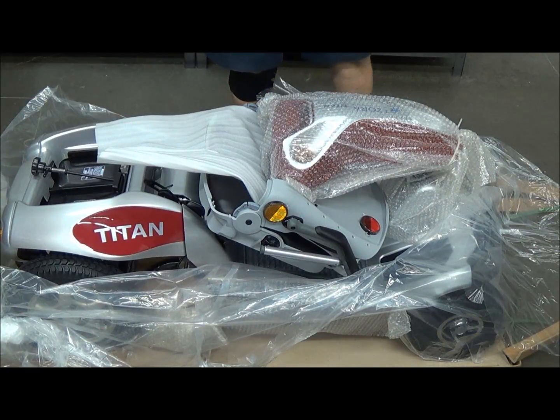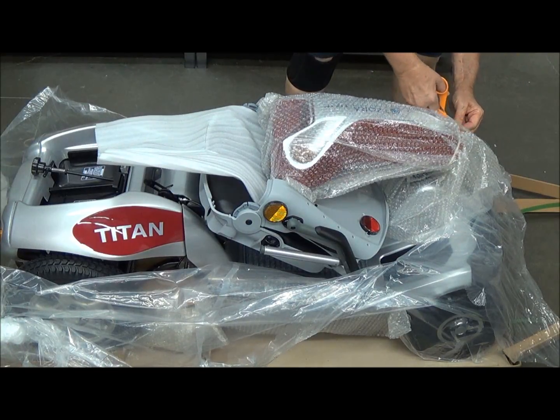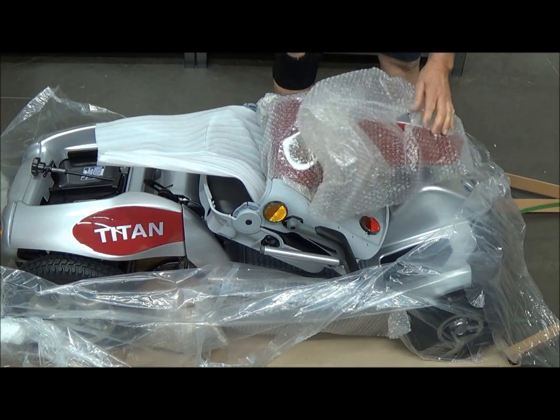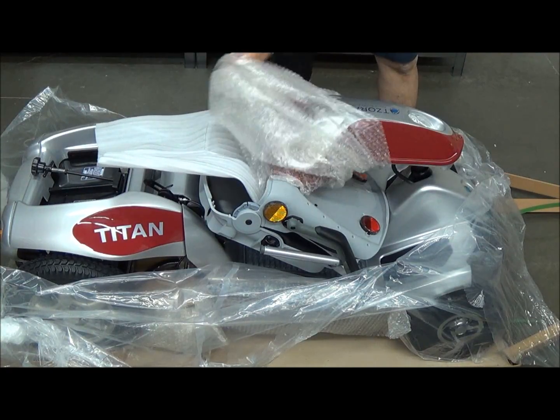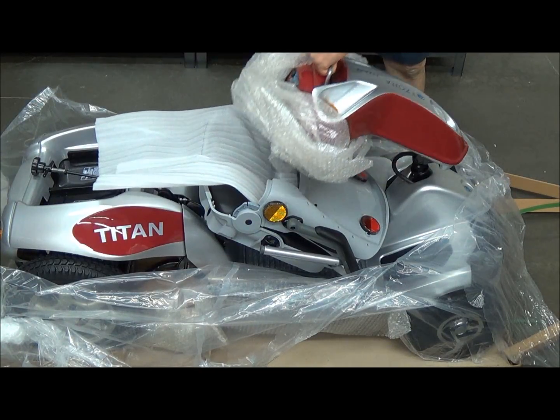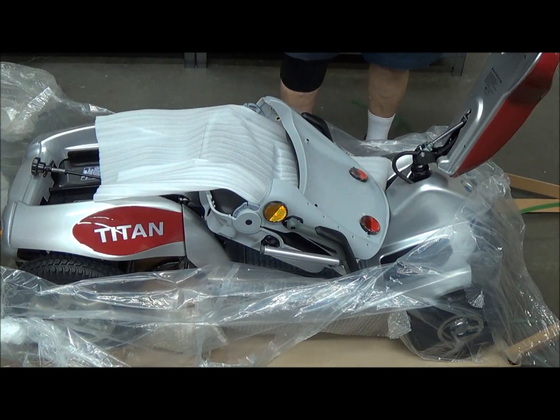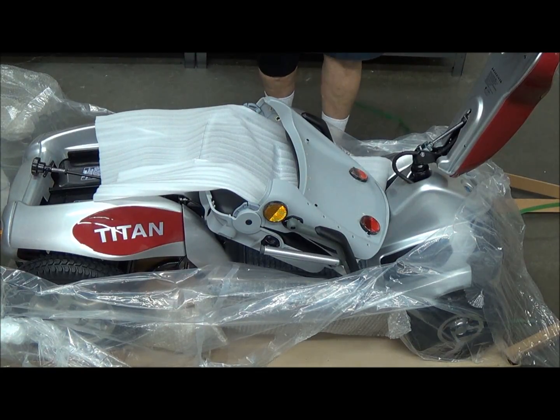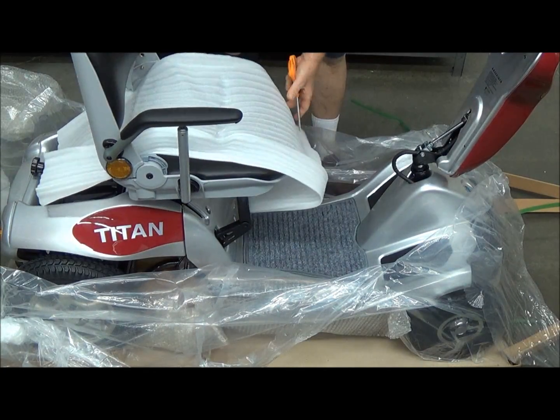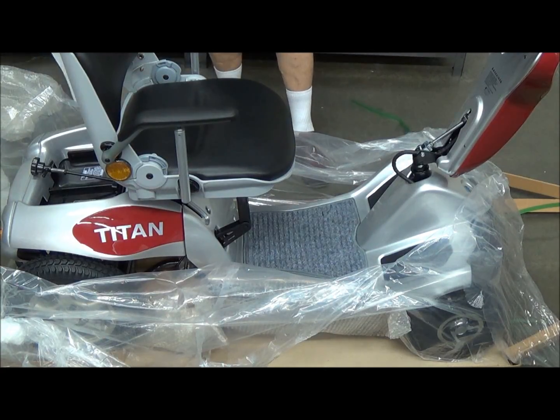Once you've got that off, you just move back to the front end of the scooter. There's a zip tie to cut right there in the front — that'll release this bubble wrap here. And then you have a handle; just pull up on that handle and you raise the tiller. Then grab the seat back and pull it up, and you're good to go there.